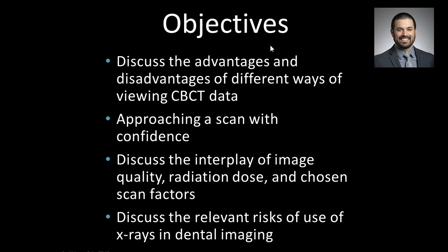Okay, here are the objectives from last week, and I just want to revisit those as a reminder of where we were and what we discussed. We visited the strengths and weaknesses of different ways of viewing cone beam CT data: the slices, the 3D renderings, and the reconstructed radiographs. And the bottom line there is, if you need to see the detail, you must be looking at those slices.